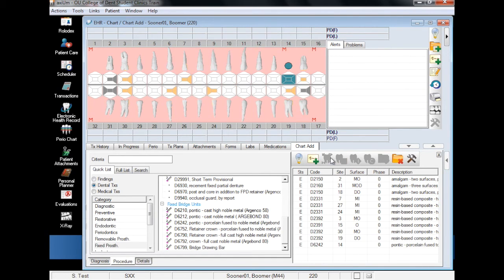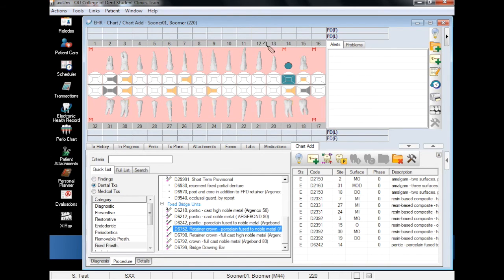Now we can add the retainer by selecting the appropriate code, keeping in mind the material type, selecting the teeth on either side of the pontic, and add finding.